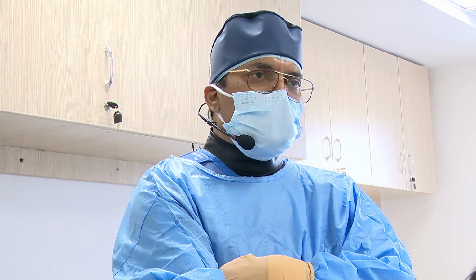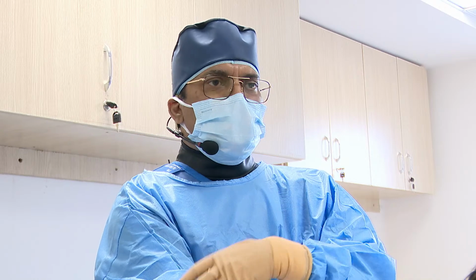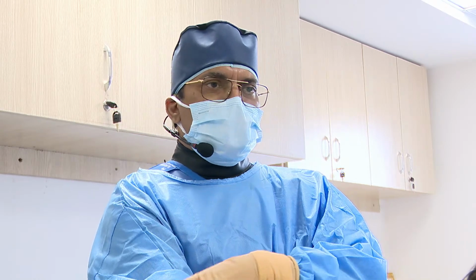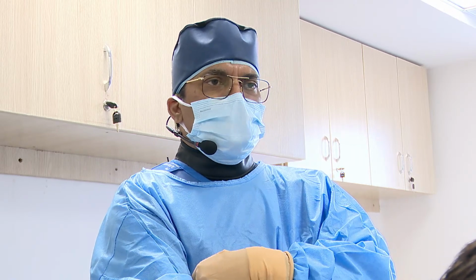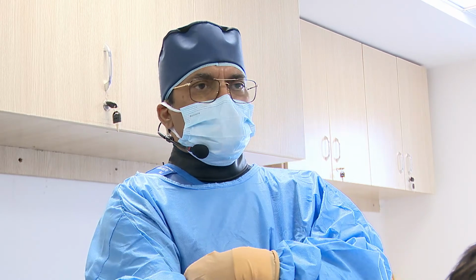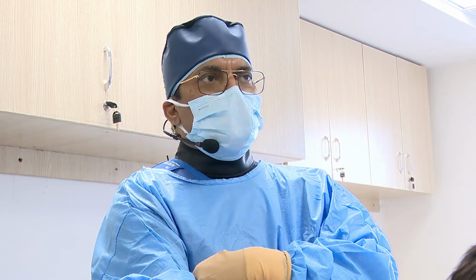This time the new version of the catheter shows higher resolution, more clarity, and higher resolution images compared to the earlier version, and it is more trackable. This shows high resolution even in distal images. You can acquire more clarity and higher resolution, and the catheter is more trackable than the earlier version. These are the advantages even distally. You can acquire longer segments, and so we will acquire the OCT.